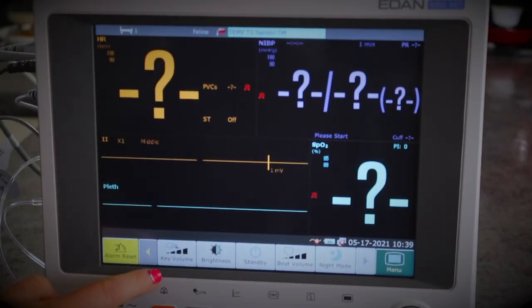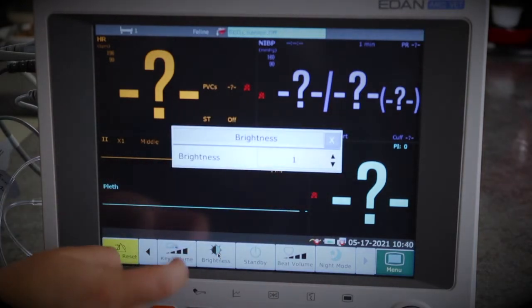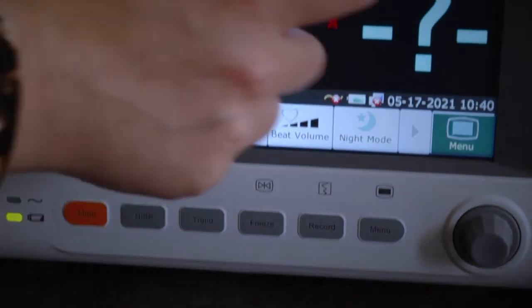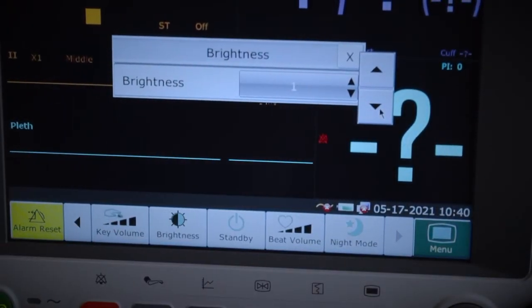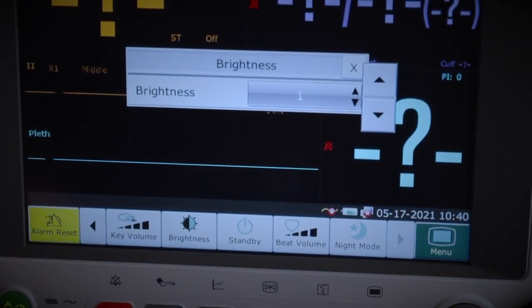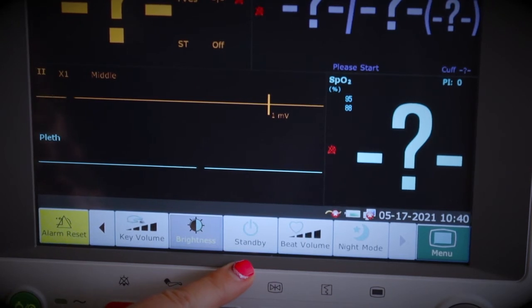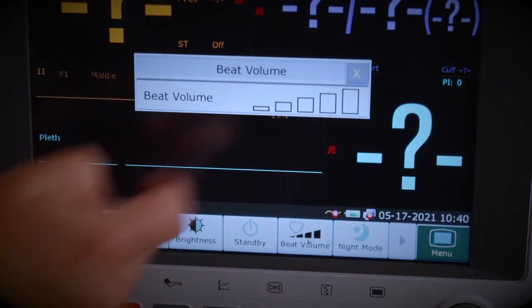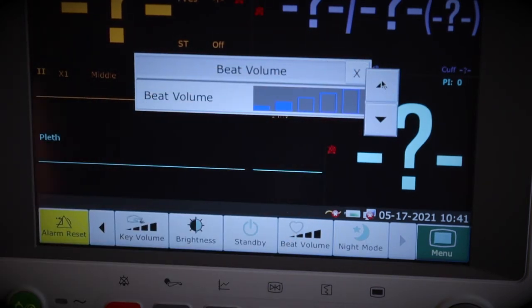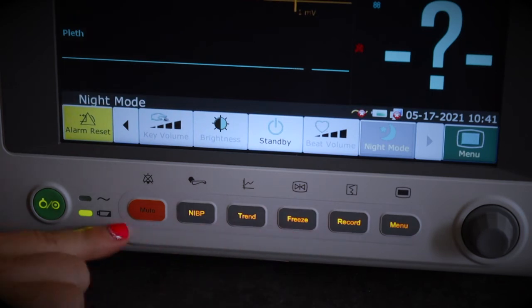Next we have key volume — you can turn it up or down to control the noise made when you click buttons. You can also select screen brightness. We recommend keeping brightness as low as possible when running on battery to preserve charge. The standby button puts the machine into standby. Beat volume controls how loud the heartbeat sound is. The last button on this screen is night mode — it dims the screen slightly and brings up the brightness on the physical buttons.